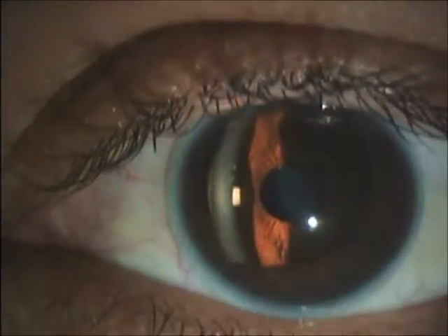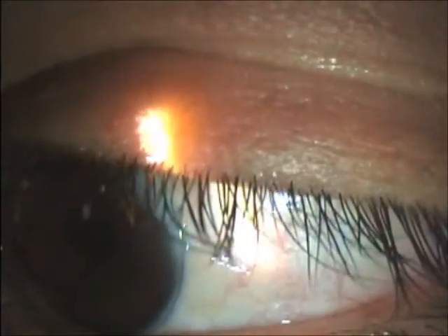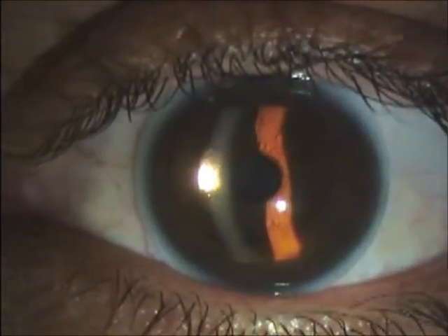The diameter of this lens is 12.7 millimeters. As it is wider than the corneal width, it improves comfort and avoids rubbing over the sclerocorneal limbus.